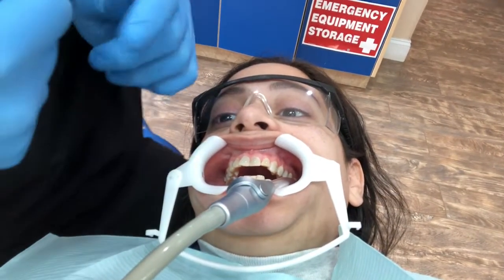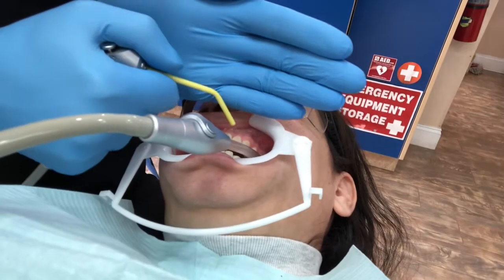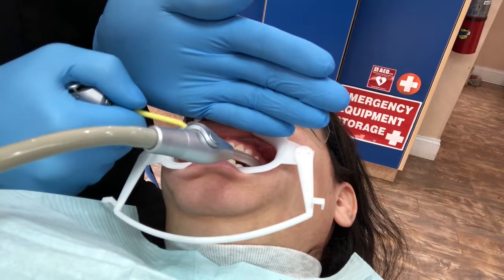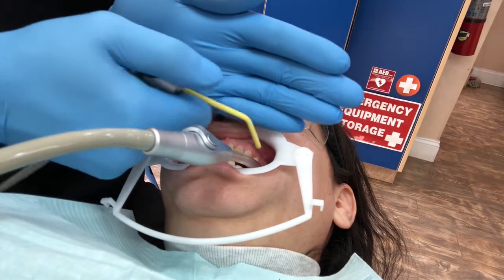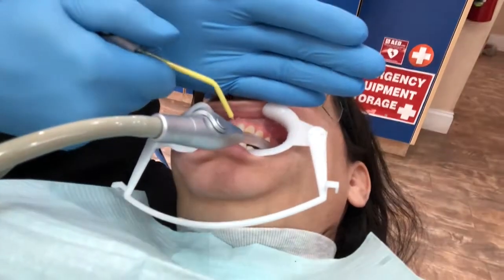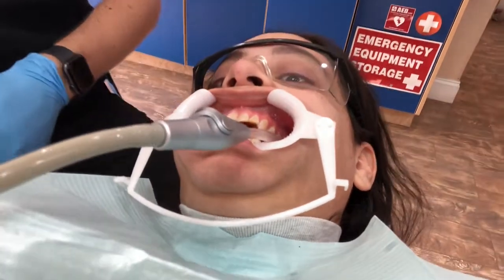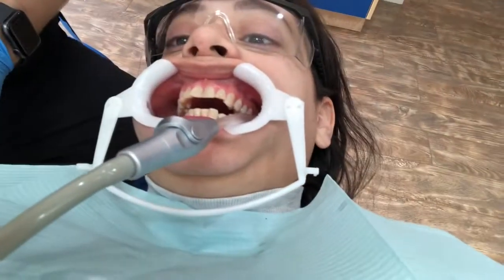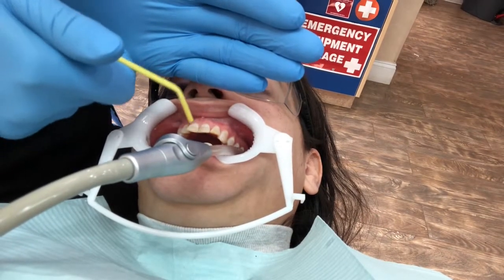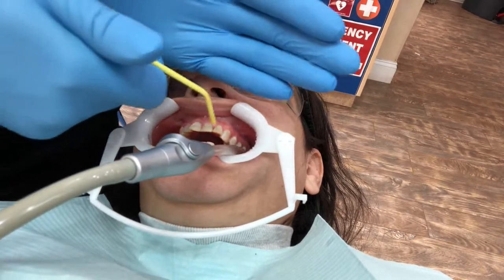Here he is drying the teeth — it's like a mini blow dryer — just to make sure that they are set and don't come off. Word of advice: if you are getting Invisalign, make sure you have a filer because these little brackets are really sharp and they don't file them for you. I had to go buy a filer.